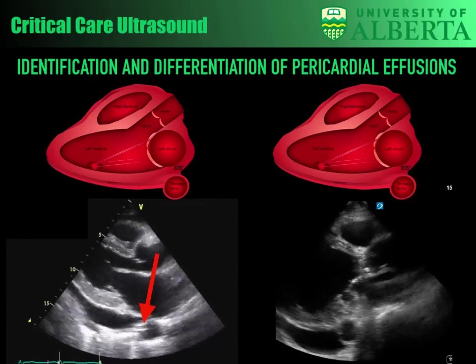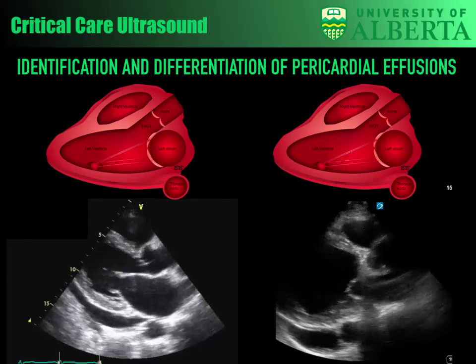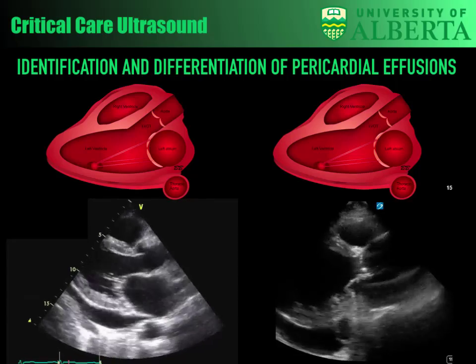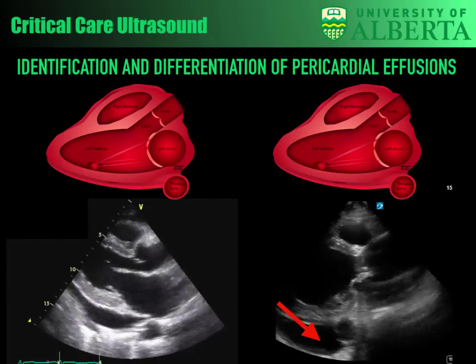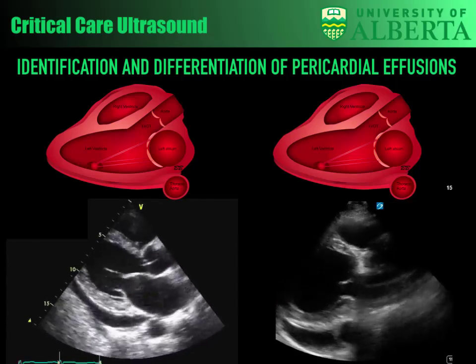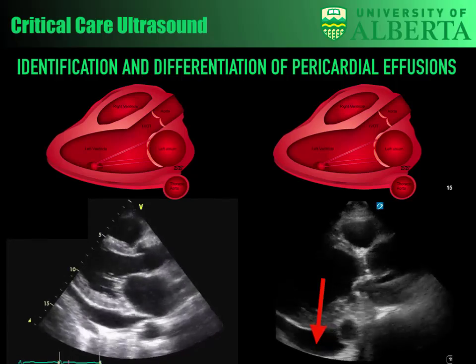So this is pericardial here, and you can see there's a large echogenic component beneath that effusion, because that's often an inflated lung, or could be an effusion itself. If someone has pericardial and pleural, you may see separation of both, with a fine echogenic line separating them. On screen right, as Adam mentioned, you can see there is this large anechoic space which goes posterior to the descending thoracic aorta. And if you look closely, maybe I can convince you that there's another layer here, and that's actually pericardial. So a tiny little pericardial effusion, which is surrounded by a larger left pleural effusion.